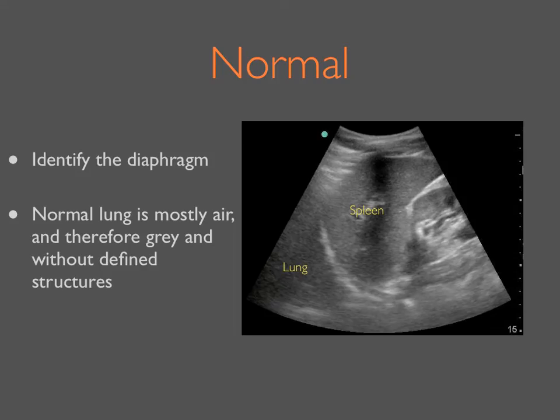The image you will see is the coronal plane image through the base of the hemithorax. Identify the curved hyperechoic line of the diaphragm as your landmark. On the abdominal side of the diaphragm, you will see the spleen or liver with their characteristic appearance. And on the thoracic side of the diaphragm, if normal, you will see a gray, foggy appearance of normal lung.